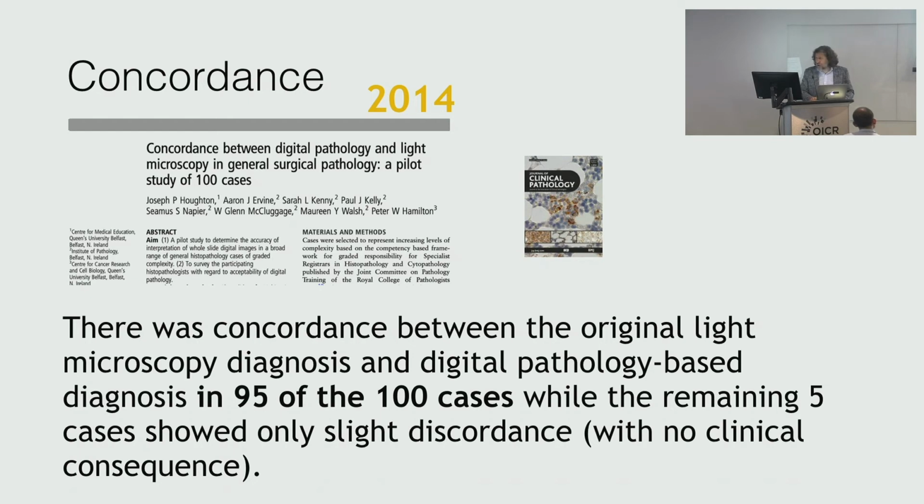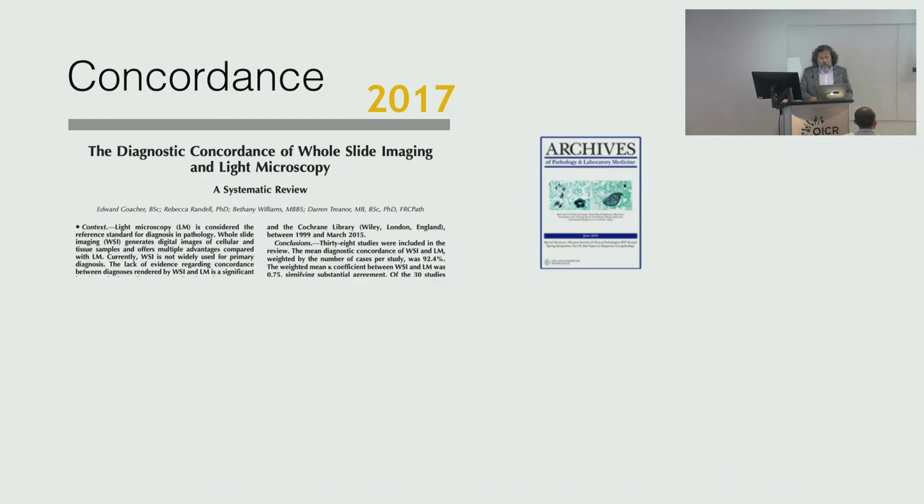This is the type of study that people do to make sure of the most important thing: would the diagnosis be the same? If anything else is different, it doesn't matter. If we can make sure that the diagnosis is the same, then we should be okay.